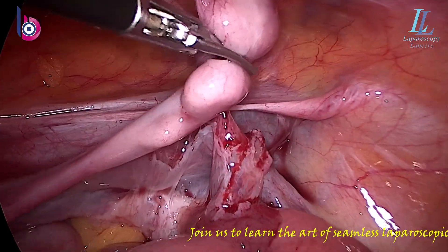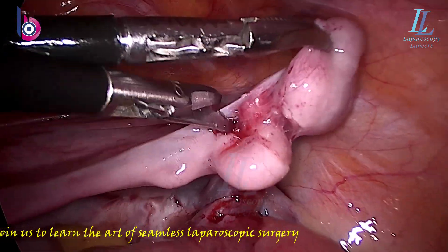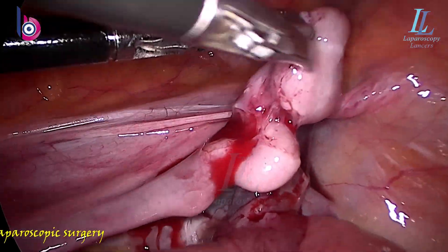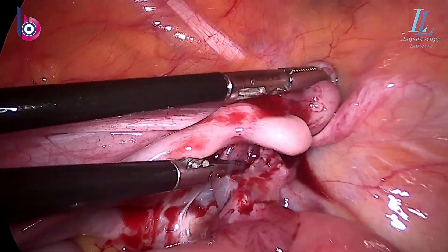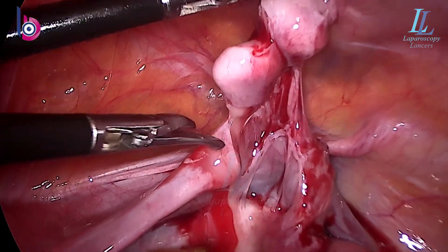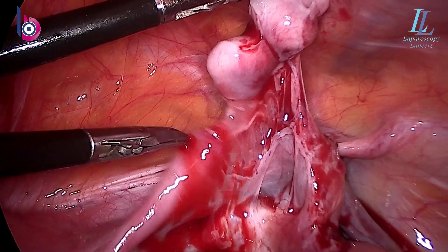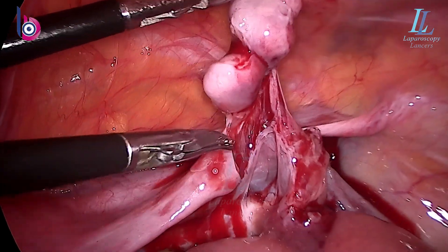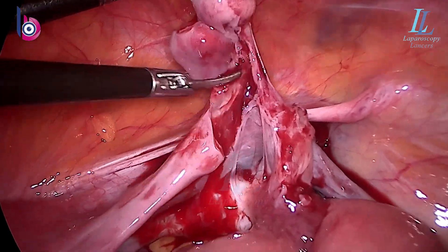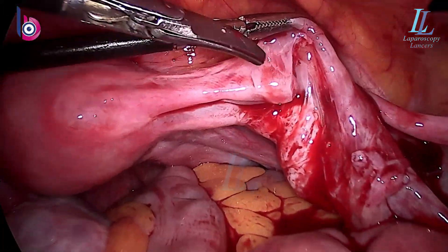I am trying to dissect the beaded tube. You must have also seen beaded tubes in some patients causing tubal blockade. Let's see what we find inside these beaded tubes and why these beadings happen. Dividing at the healthier part — and see, lots of pus coming out; maybe it's an antibioma. Now I know exactly why the beading happens: it is because of contained pyosalpinx, or you can say antibioma, inside the cells of the fallopian tube.